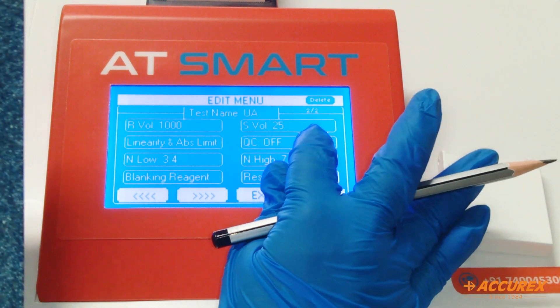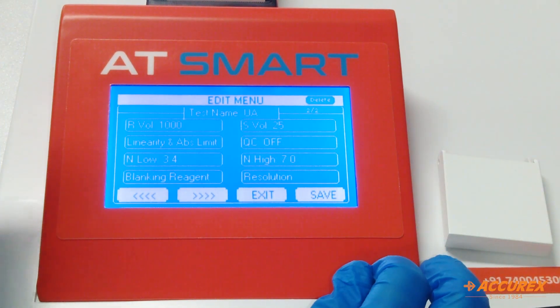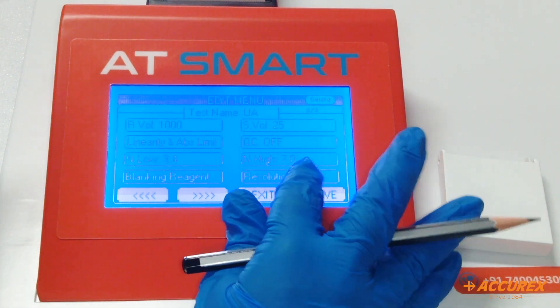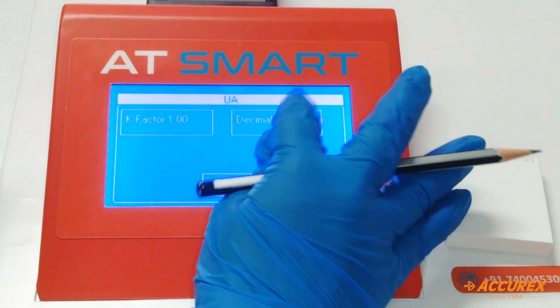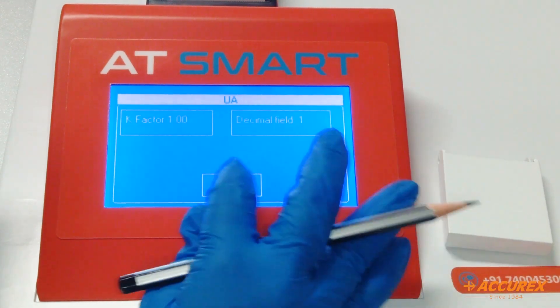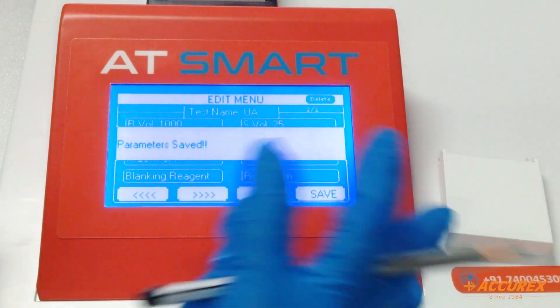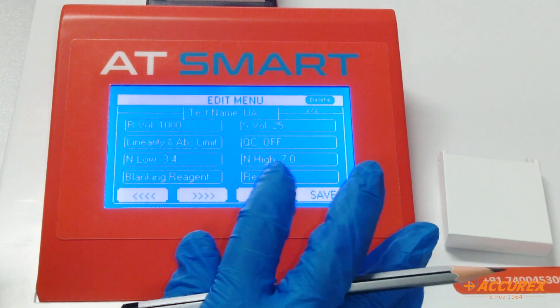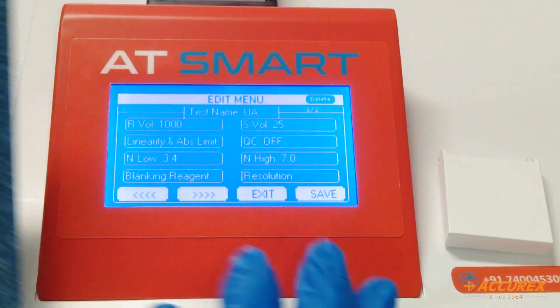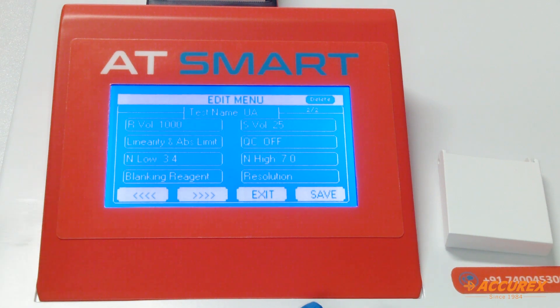For QC, if you want to check QC, there is an option. Resolution — decimal is 1, so select 1 and enter, and save. In this manner, you can program any chemistry on a semi-automated analyzer. Thank you.